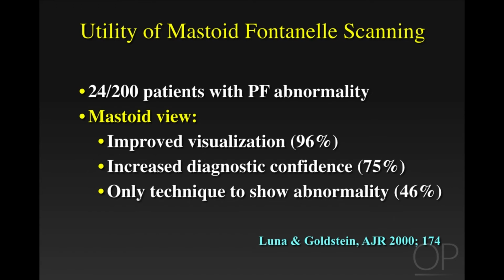The mastoid fontanelle is actually very, very helpful in visualizing patients with posterior fossa abnormality. In this study by Luna and Goldstein, the mastoid view improved visualization in almost all cases, increased diagnostic confidence in 75%, and most importantly was the only technique to show an abnormality in 46% of patients. And this has been our own experience at our institution.